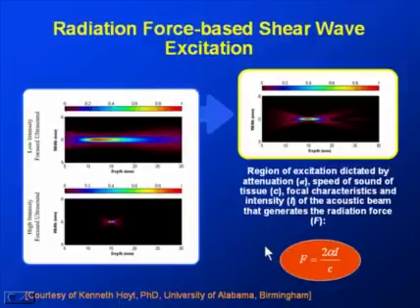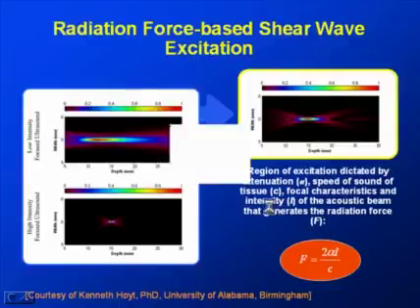And this will then start shear waves to propagate laterally out from the beam. If you then fire subsequent low-intensity pulses that's shown up here, you end up with an overall overlap between the two, like depicted here. And it's those pulses that will enable you to track the velocity of the moving shear waves, and therefore the associated Young's modulus.